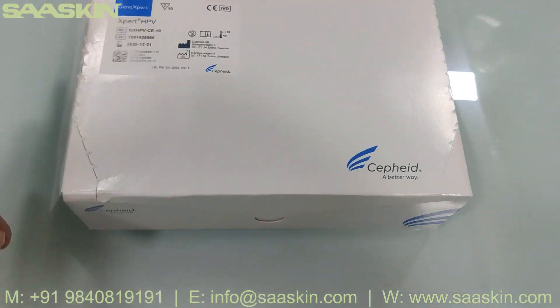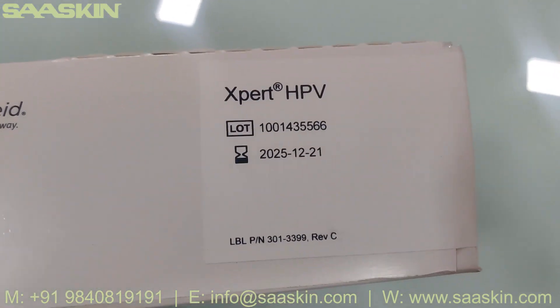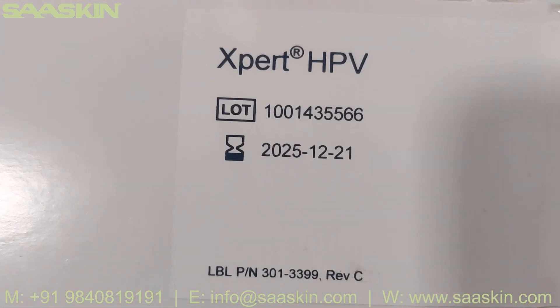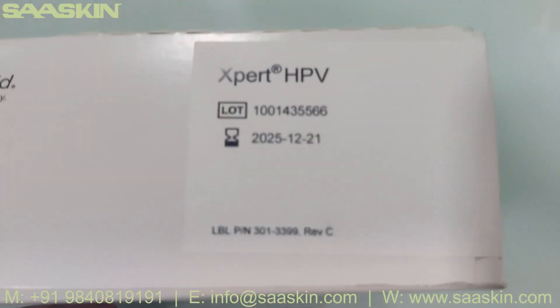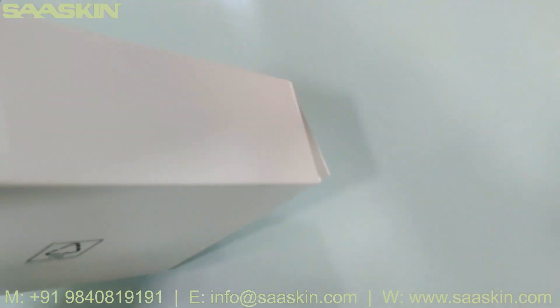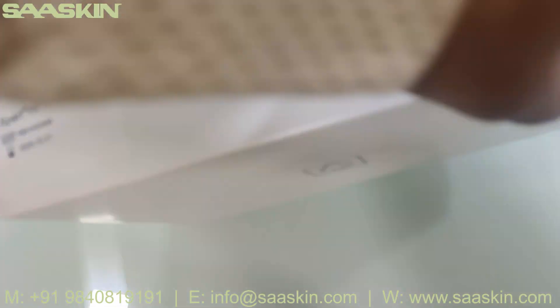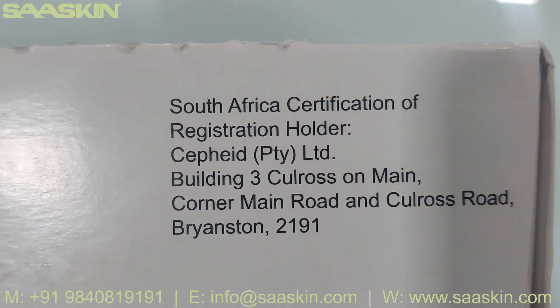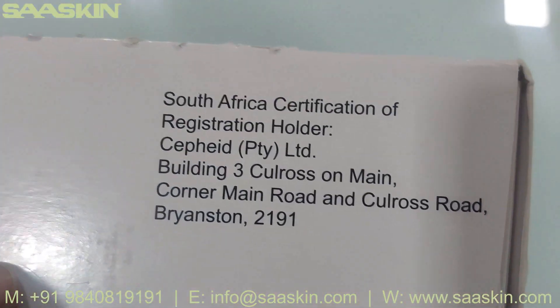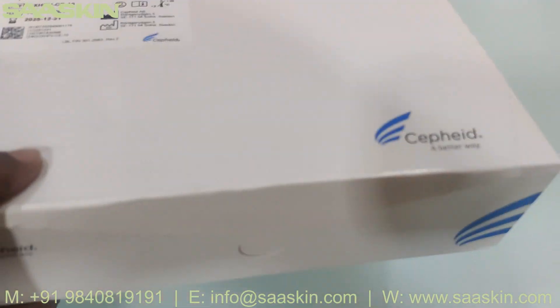Let me show you around the box — this is what the box looks like. On the other side you can also see the lot number and the expiry date. Here is the bottom side, and the other side as well — this is how the total box looks.